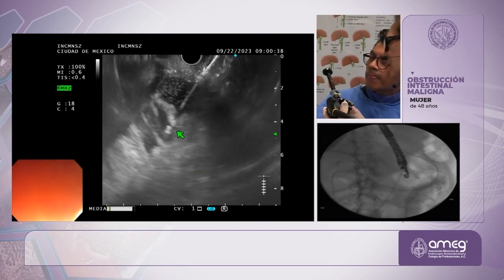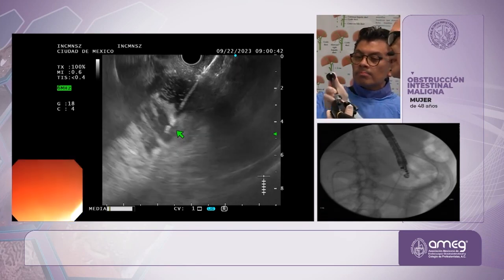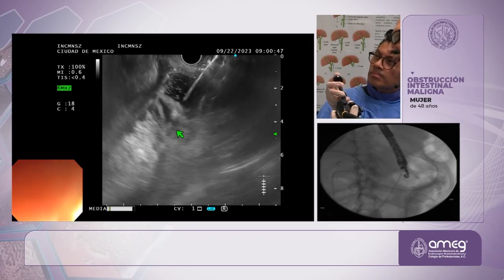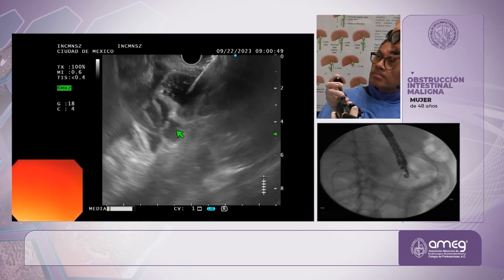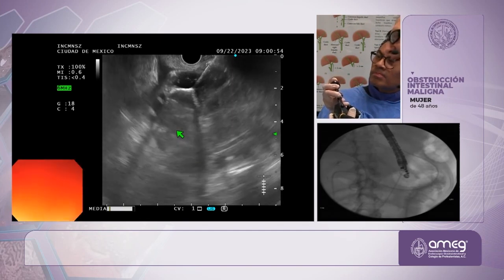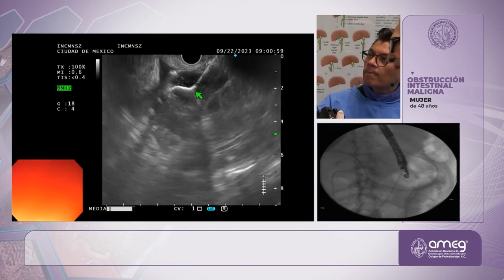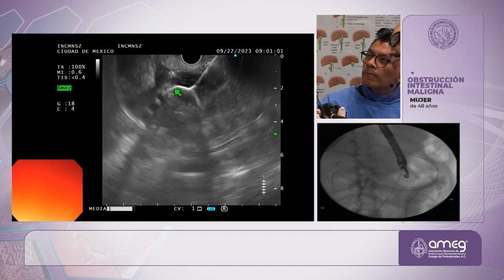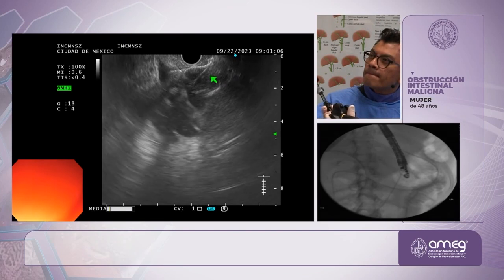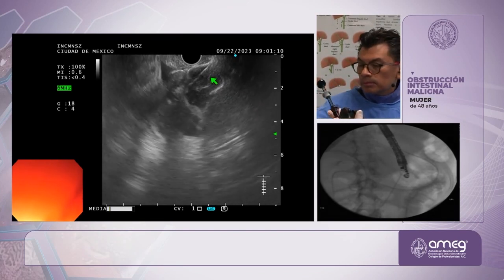And now I'm going to lock. I'm going to release the safety so that I can deploy the distal flange very slowly, very slowly, very slowly. Let's watch it open up. There it is. It's coming. Now it's fully open. Just give it some time. Make sure it's fully open. All right, now we can snug up. I'm just going to pull up like this, and wait till it just deforms a little bit and you see a little bit of asymmetry. Okay? So it looks perfect right now.